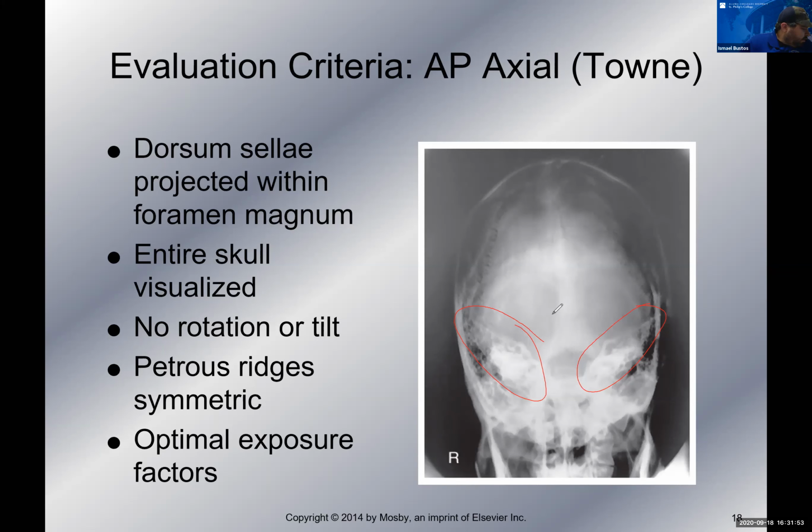Make sure I'm covering everything here. And then optimal exposure factors, right? Make sure you have sharp lines, bony trabecular markings. You can see all those structures, okay?